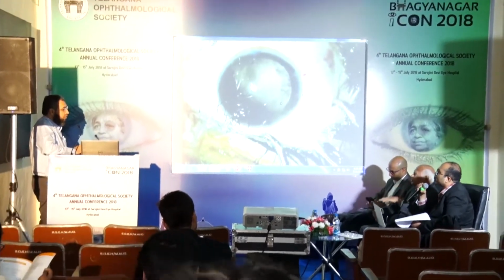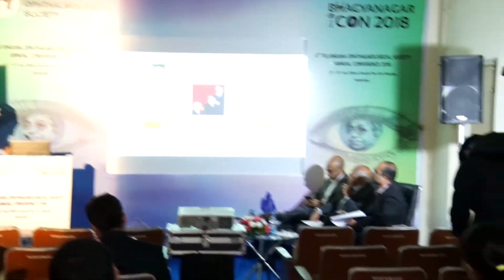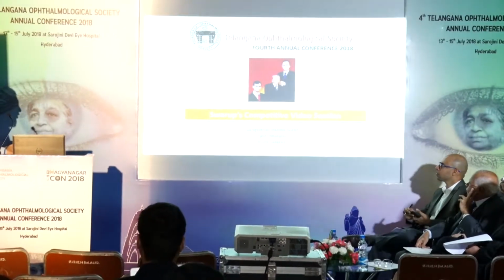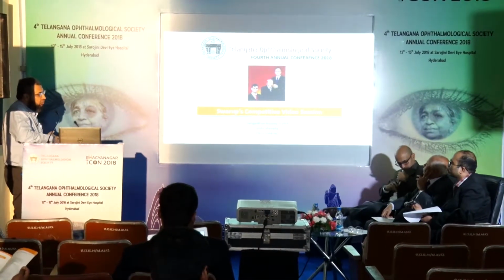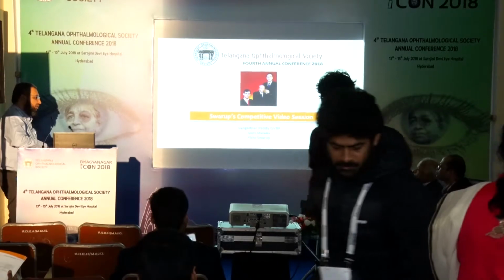No, it was not the super intumescent kind of thing, but what I showed you, the previous phacomorphic one, or something like that. I keep doing these glaucoma surgeries. The technique that I use, I stick to that only. Since the last 2-3 years I have been doing that: giving glycerol prior to surgery, then using Viscoat intraoperatively, and then completing the capsulorhexis with the forceps.